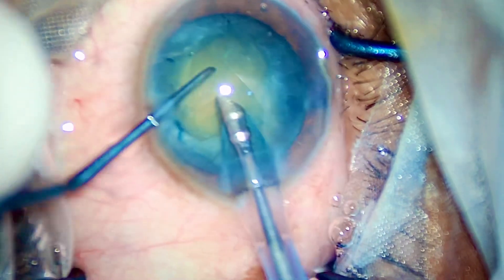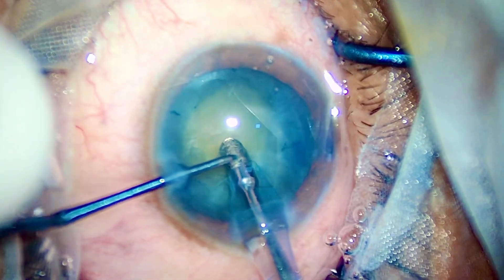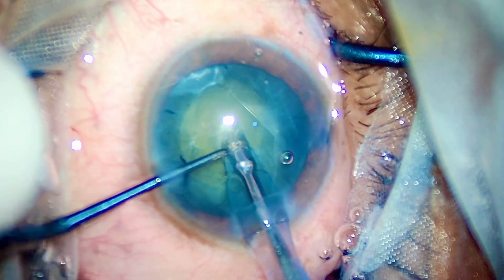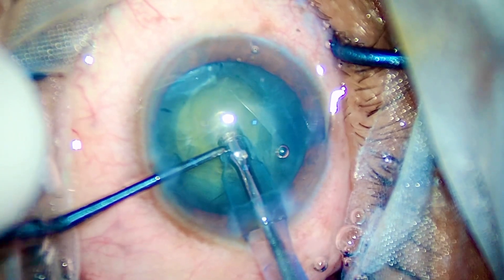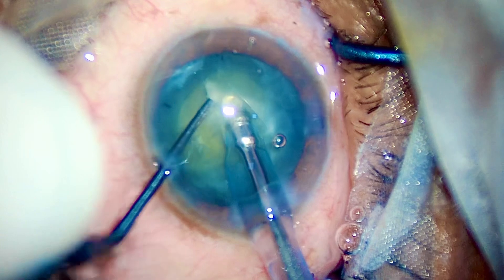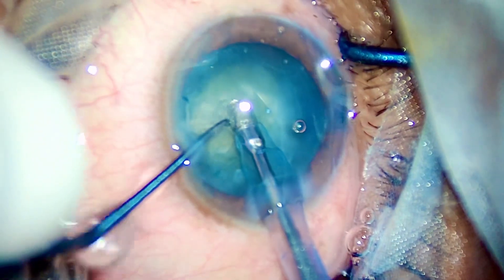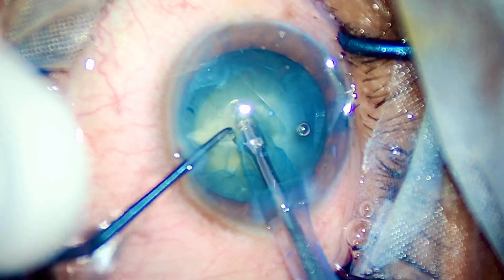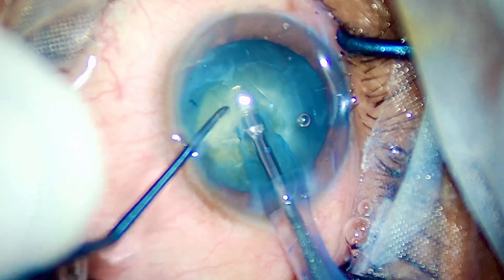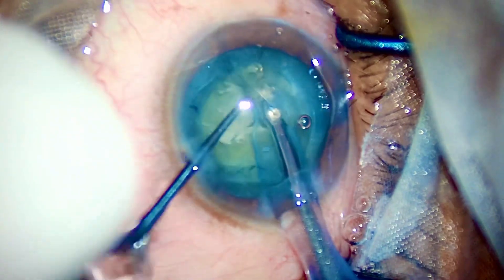Once you dilate a patient and make them sit on a slit lamp, the observing surgeon should just clap for the operating surgeon seeing the rhexis — that should be the brilliance you strive for. That's what I have believed in. Going ahead with the case, I am starting with vertical chops, and here you go — I have created a good chop.